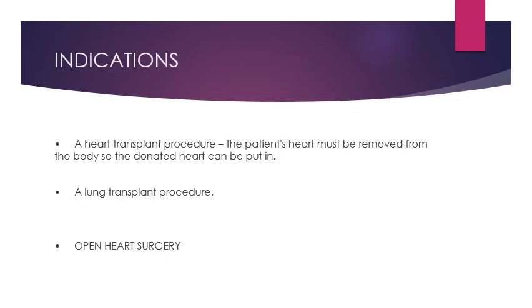Now, it has certain indications. Let us have a look. It is indicated in a heart transplant procedure where the patient's heart must be removed from the body so that a donated heart can be put in. A lung transplant process and an open heart surgery, which is also called a CABG.